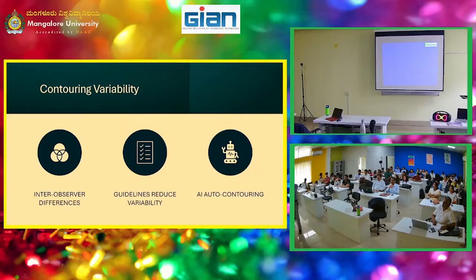What you want to do is create an algorithm that's going to automate the process and reduce that observer variability. It is absolutely trained on radiologists, which is called an imperfect gold standard. Imperfect, because they don't know either. If you actually sampled cells, then that's a gold standard.